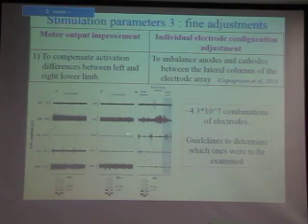And this is just an example of how we try, for example, to unbalance anodes and cathodes between the lateral columns of the array to try to increase, in this case, proximal muscles of the right lower limb. So we put an anode here and a cathode on the left, and we got something closer to what we wanted.